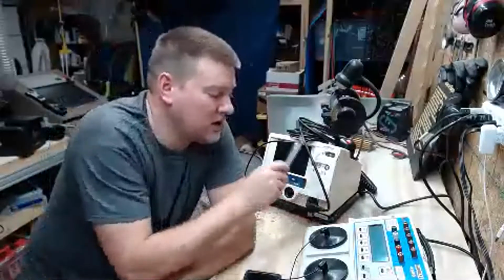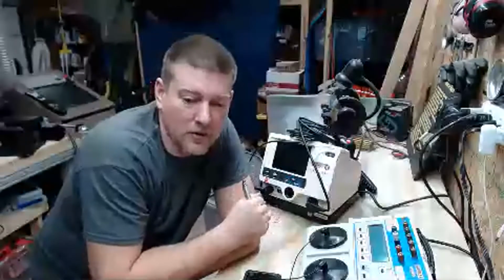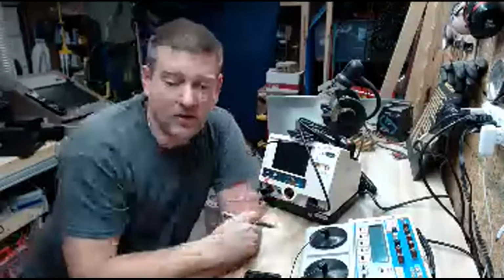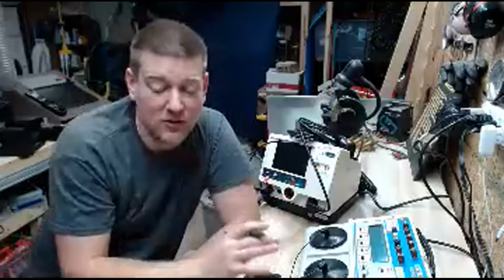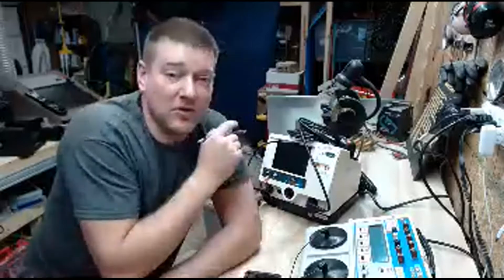Because what they'll do, have some doctor that will say, hey, isn't that the defib that messed up a month ago? It might not be. They all look the same, right? So ship it back to the manufacturer and have them recertify it if you have an incident investigation involving a patient.